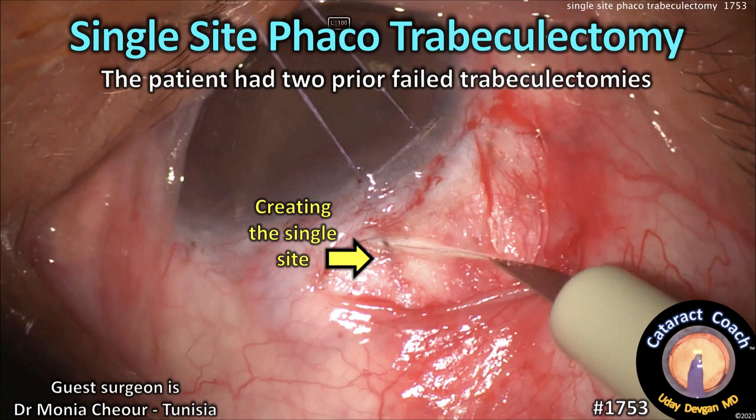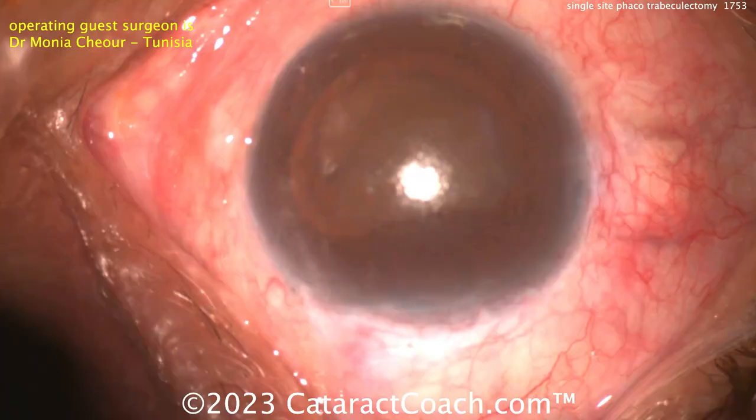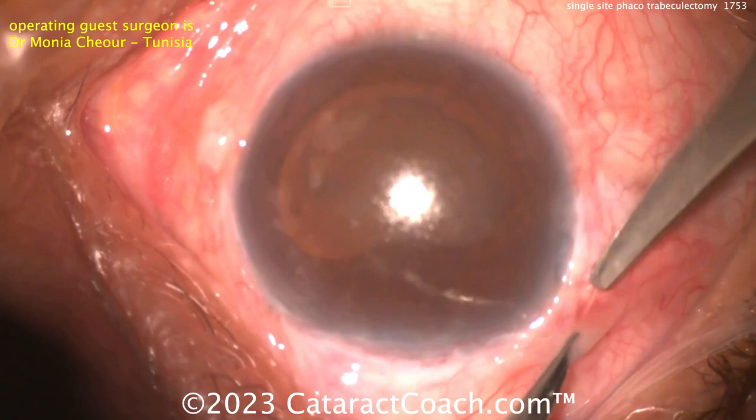CataractCoach.com, single-site phacotrabeculectomy. This patient had two prior failed trabeculectomies — you can see those are the two sites of the prior failed trabs. Now this patient needs to have cataract surgery and another trab, so the surgeon is going to do a single site for both.